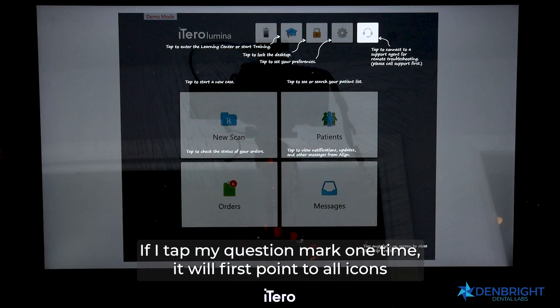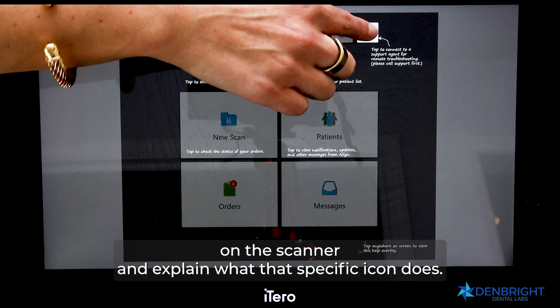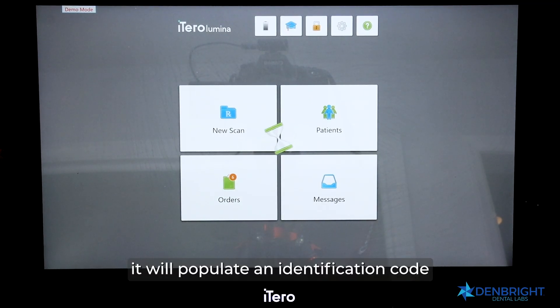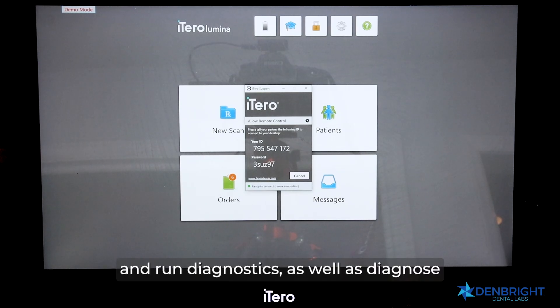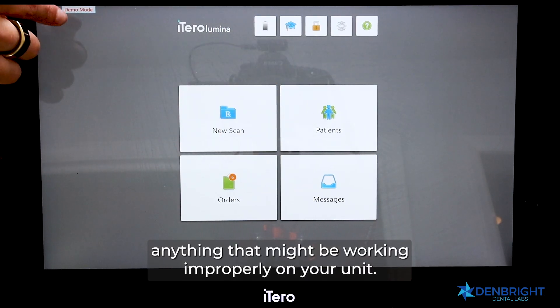If I tap the question mark one time, it will point to all icons on the scanner and explain what each specific icon does. If I tap the new button — now shown as a headset — it will populate an identification code that I read off to the support team on the telephone. This allows them to log into my scanner, run diagnostics, and diagnose anything working improperly on the unit.